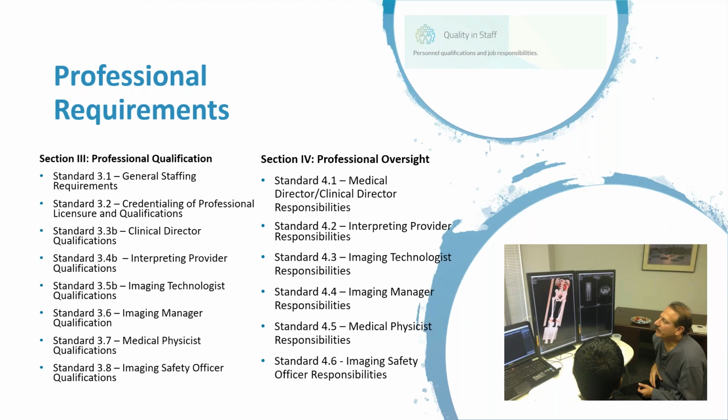And then we likewise with 3.4B specify the interpreting provider's requirements, 3.5B, the imaging technologist, 3.6, the imaging manager. Then we talk about the medical physicist requirements. And then finally, at the end of that section, the imaging safety officer's requirements. The idea is to make sure that there's an ecosystem of people in place that are properly qualified for the roles that they have, while recognizing that the norms in dentistry are different.